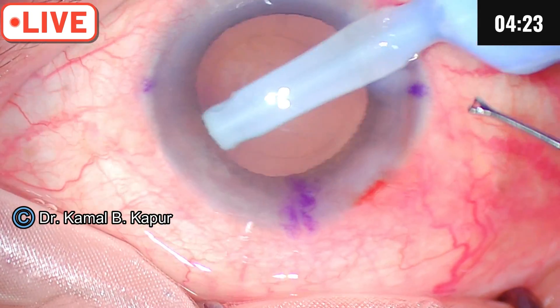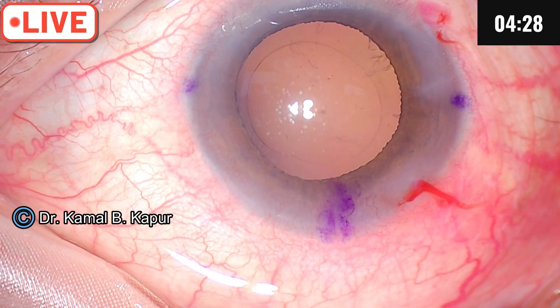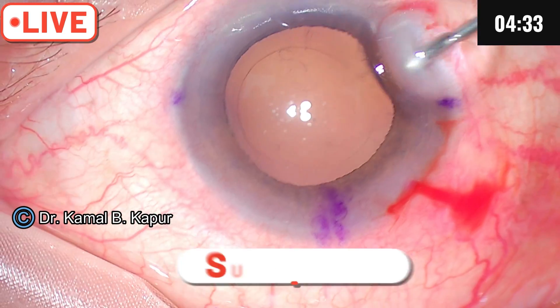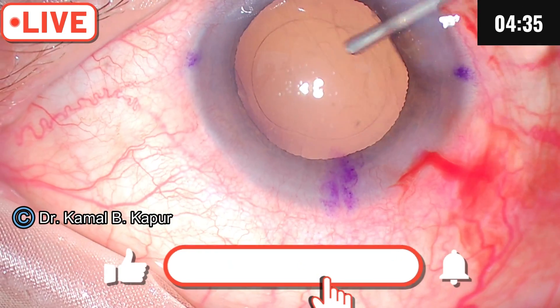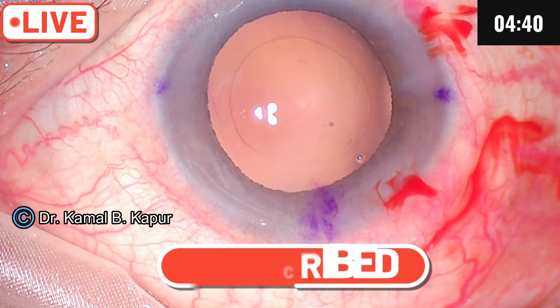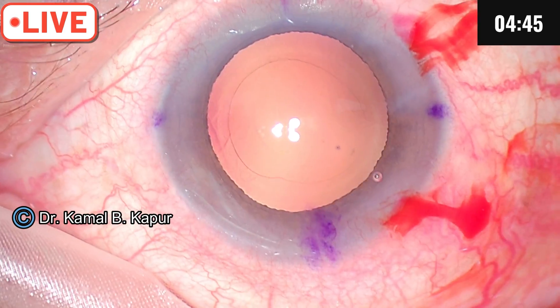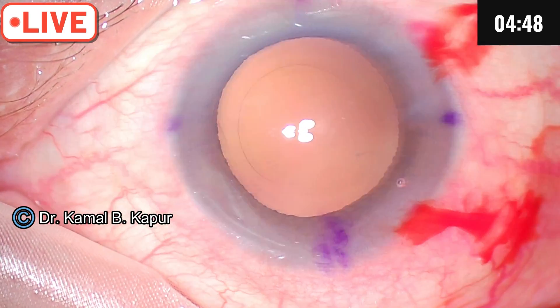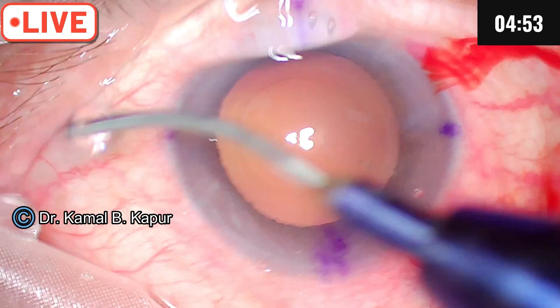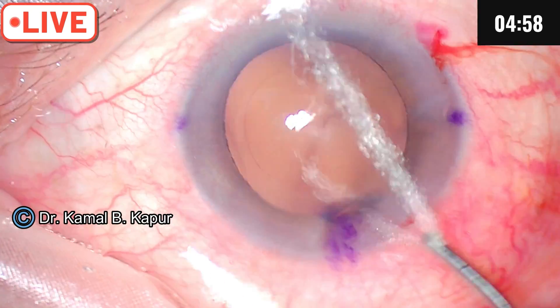We are using a toric lens here; the patient has astigmatism of 4 diopters. We install some viscoelastic into the bag to distend it, and we are going to insert the lens. A key trick when inserting a toric lens is to always try to slightly under-rotate, because final rotations for alignment may not be possible in the reverse direction.